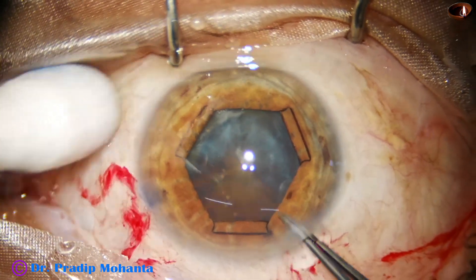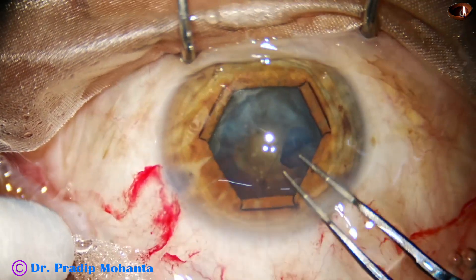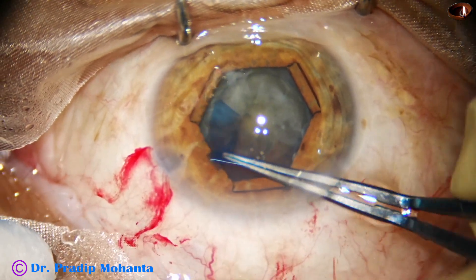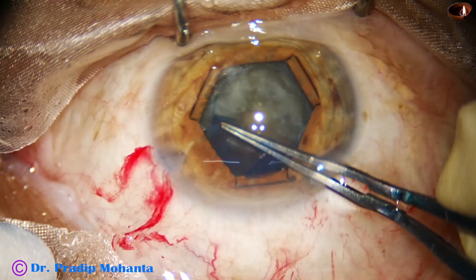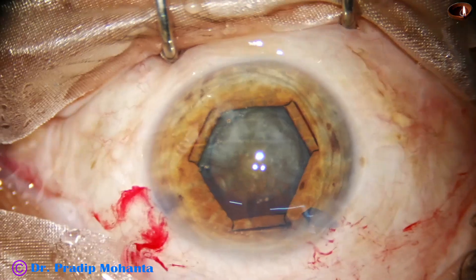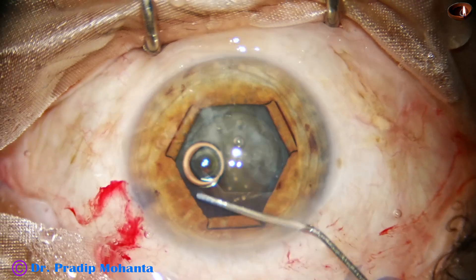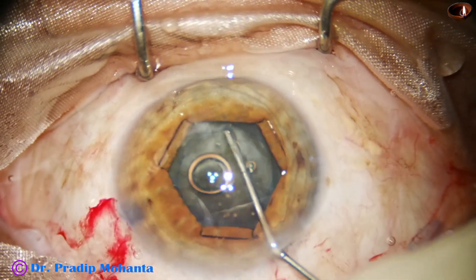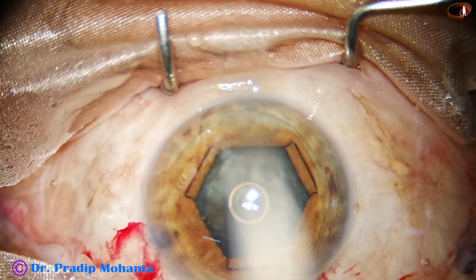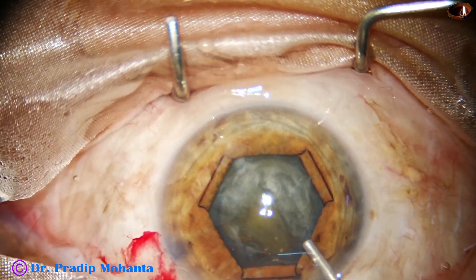And now capsulorhexis is done. I use utrata forceps and the hexagonal rhexis is done. And now hydrodissection is done. The size of the hexagonal rhexis is about 4.75 millimeters in this case; it should have been a little larger, about 5 millimeters.